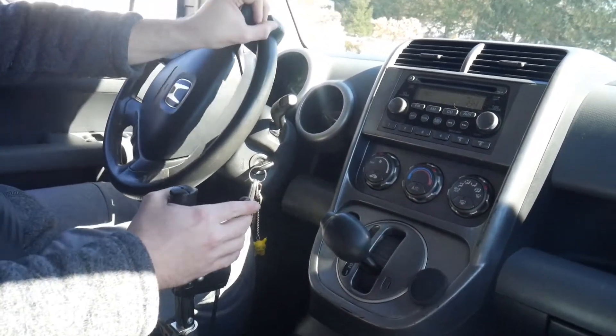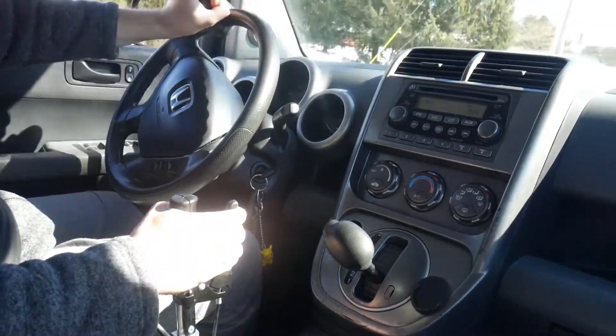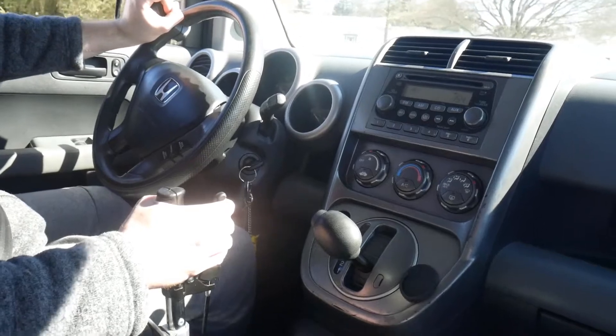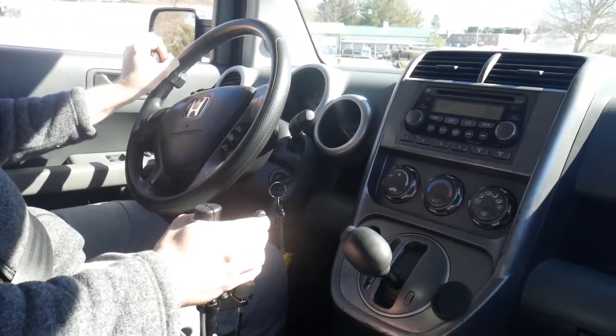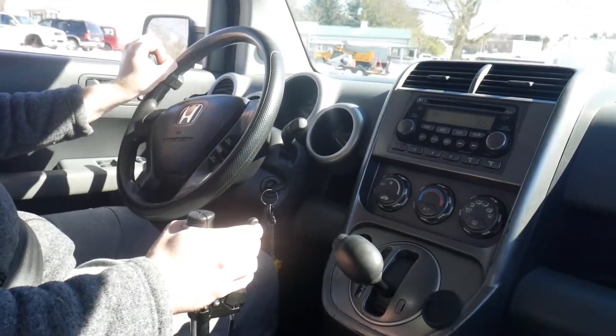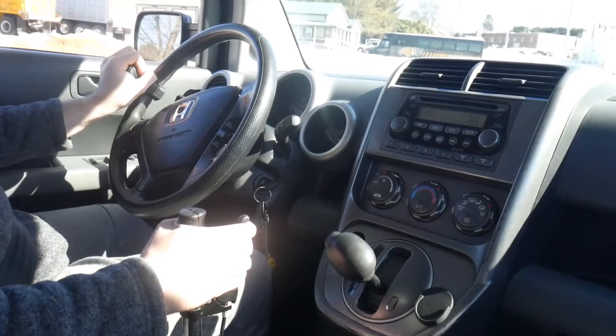I put it into reverse, park, drive, and everything. I actually press forward with my foot to put it into gear, then put my hand on the lever. I let go of the brake with my foot, get it out of the way, and then use the hand controls.